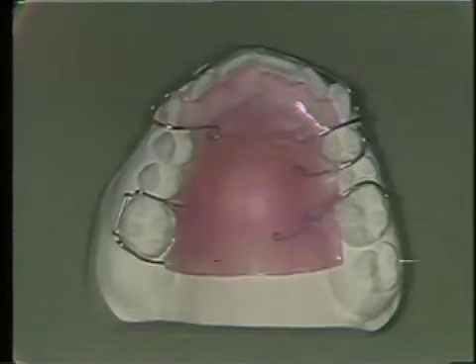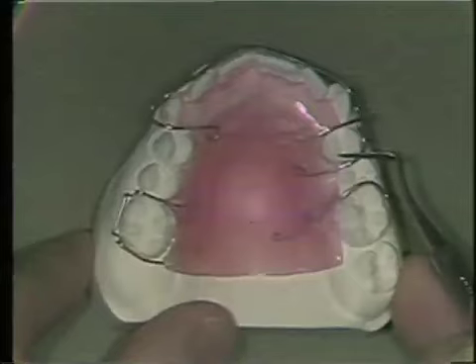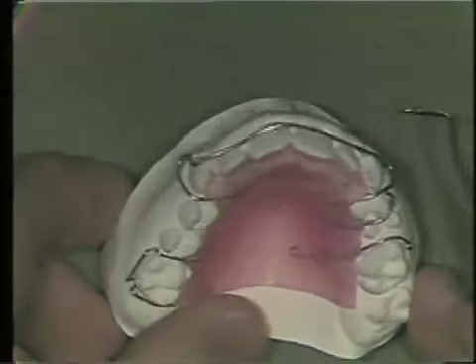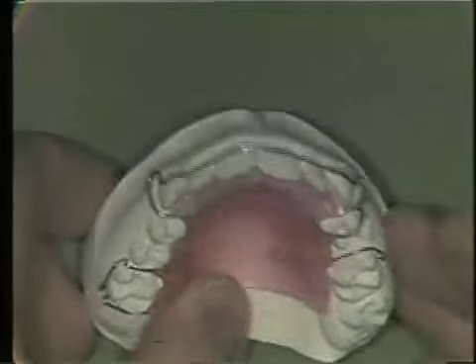There are three main types of wires used in removable acrylic appliances: clasps, labial wires, and springs.